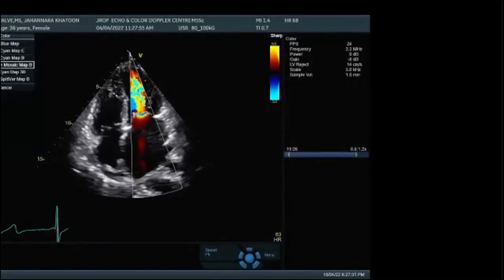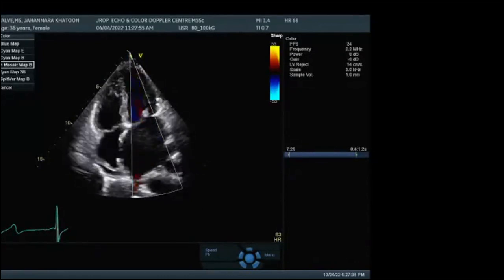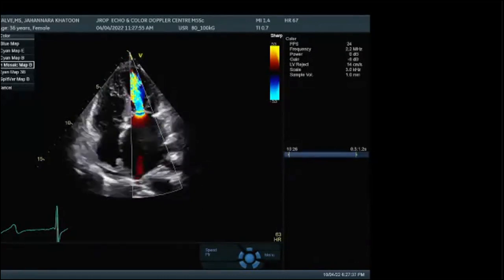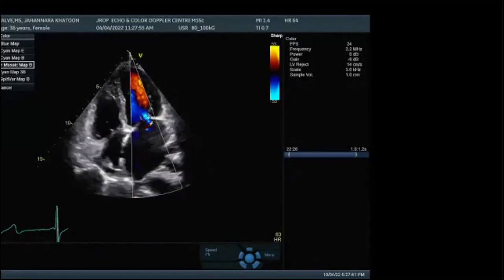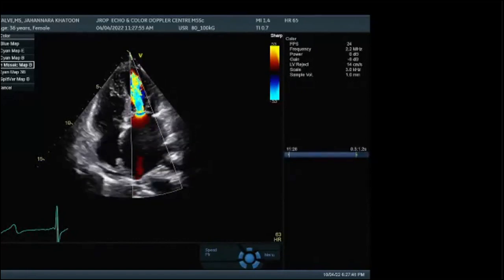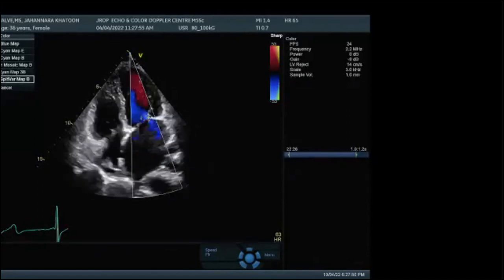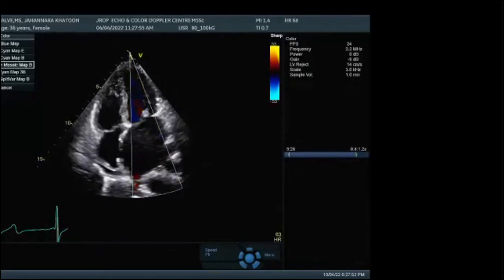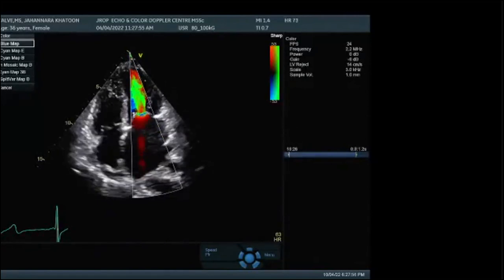Now, see the red and blue colors. It all depends on which you are comfortable with. Okay, sir. Thank you.